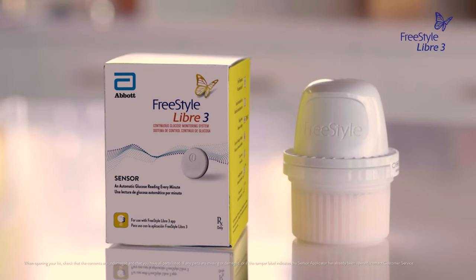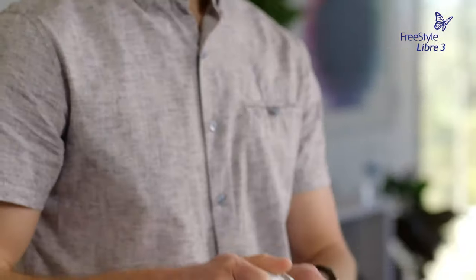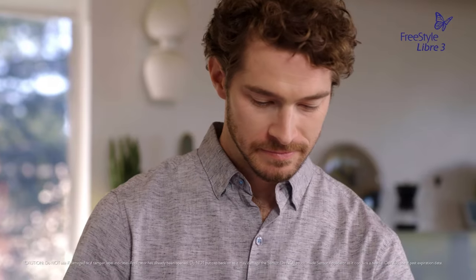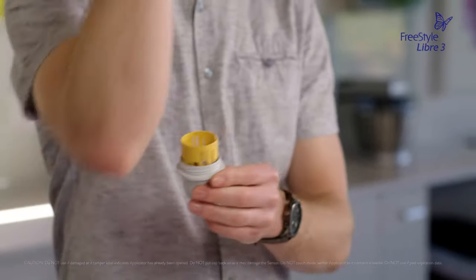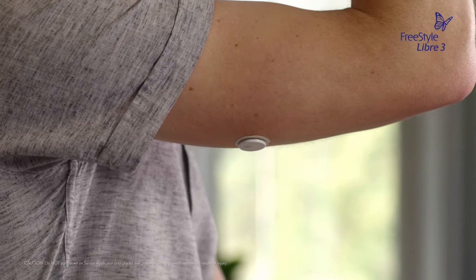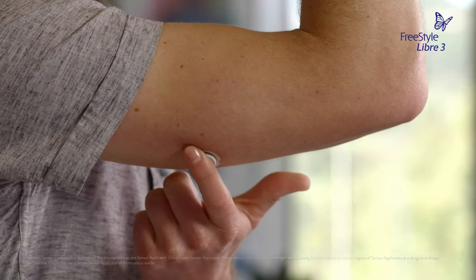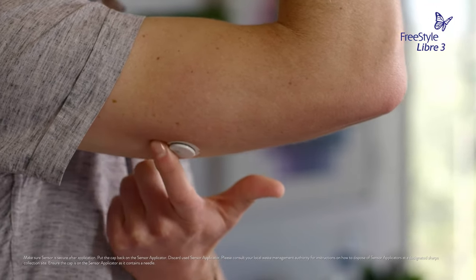After you have finished preparing the back of your upper arm, you are ready to apply the sensor. The Freestyle Libre 3 sensor and applicator already come assembled for you. Simply unscrew the cap and set it aside. Do not put the cap back on, as it may damage the sensor. Place the sensor applicator over the prepared site on the back of your upper arm and push down firmly to apply the sensor to your body. The sensor should now be attached to your skin. Then make sure the sensor is secure by gently pressing down with your finger around the edge.